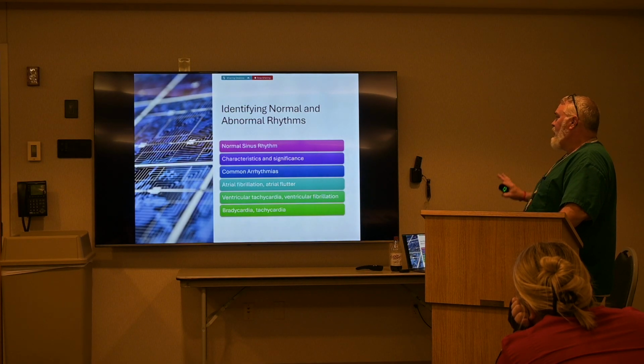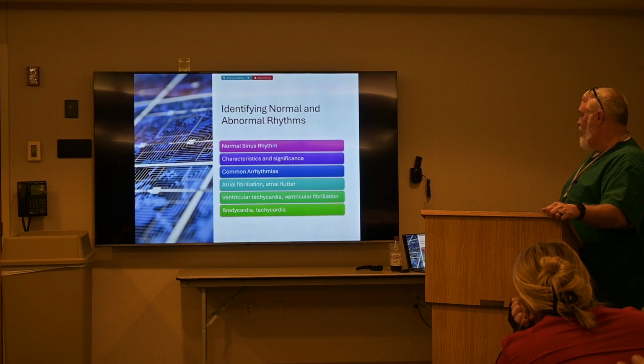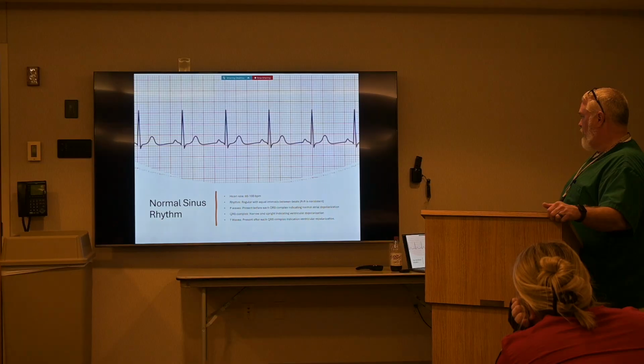So we're going to talk about some normal and abnormal rhythms. We're going to talk a little bit about normal sinus rhythm, characteristics and significant, common arrhythmias, atrial fib and flutter, VTach, VFib, and then some bradycardias and tachycardias.